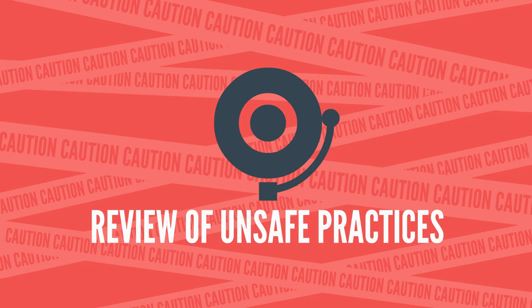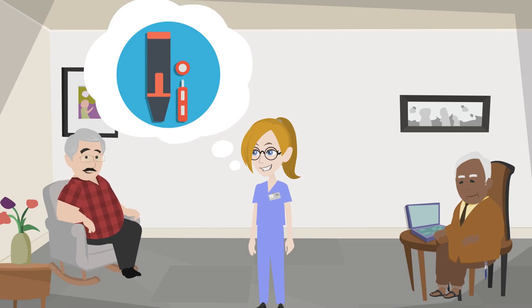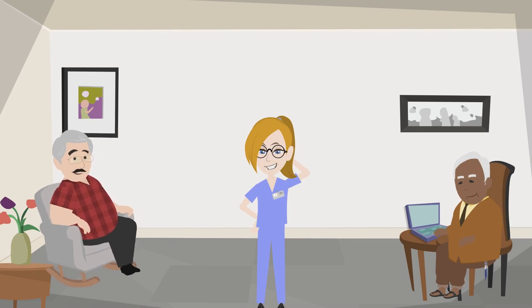Let's look together at the following review of unsafe practices and see if you can spot what is wrong in each of the following scenes. This is Angela. She is assisting the residents with their blood glucose monitoring. She uses the same fingerstick device but changes the lancets between the residents. What was wrong with this picture?